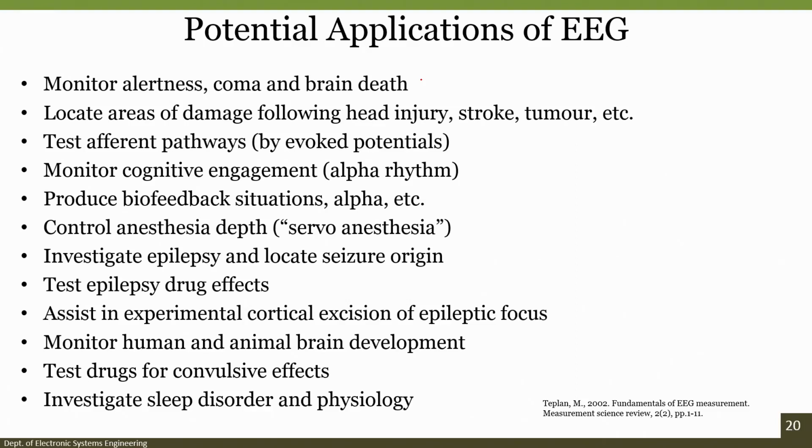or for some applications. Assist in experimental cortical excisions and epileptic focus, monitor human and animal brain development, test drugs for convulsive effects, and finally investigate sleep disorder and physiology. So, there are many applications of EEG because finally EEG is related to nothing but your brain waves, and brain waves show a lot of interesting applications right from the deep sleep to a person whether he is in coma or not, to a person whether he is attentive or not.